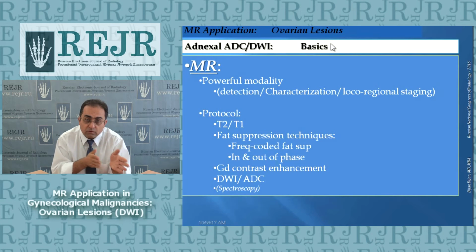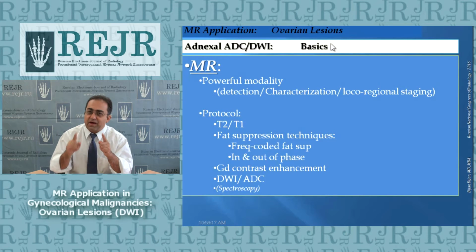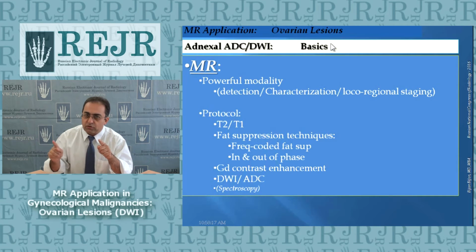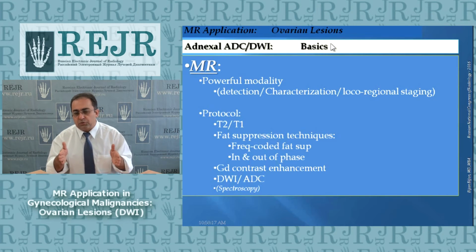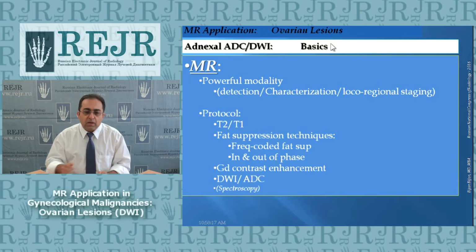This needs to be done before your contrast. Now, this is different than your T2. Your T2, in theory, can be done after your contrast. With the one caveat that I need to mention, that contrast affects T1, but it also affects T2. This is not something that everybody pays attention to. Contrast also affects your T2 images. Now, it is not clinically that significant to do the T2 after your contrast. If you have to, you can do it. In most of the protocols that I have, I try to minimize the duration of the imaging to under 30 minutes, preferably in the 20 minutes time.